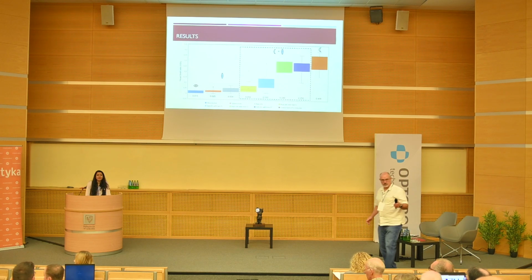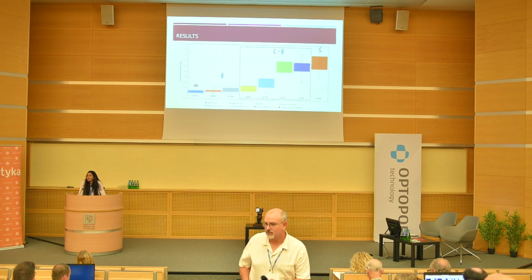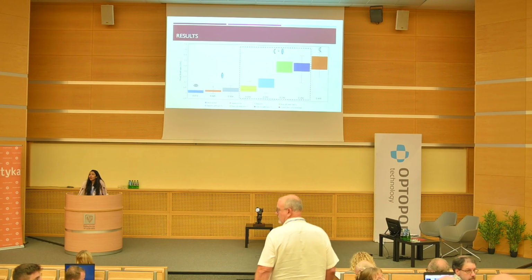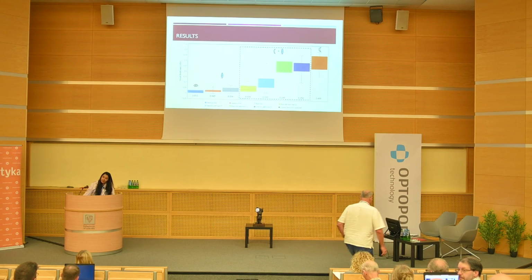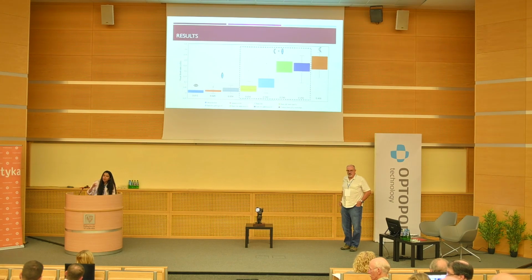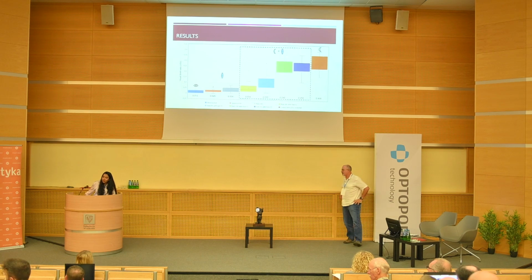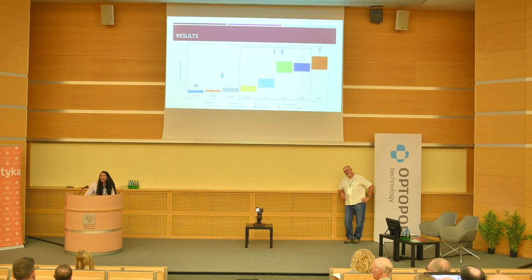Yes, thank you for a nice talk. I would like to ask you, it's not clear to me why the contact lenses by themselves would be the best option. Because it's RGP, gas permeable contact lenses, and when it is put on the keratoconic cornea, which has a distorted shape, between the lens and the cornea there's a tear layer, so it corrects the aberration. Yes, but I was wondering why it performs better when you don't have the IOL there? That's what you're showing.